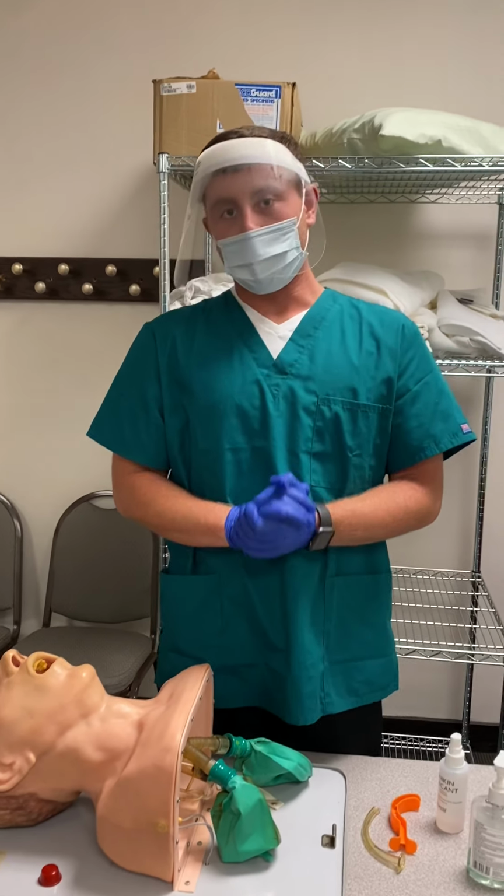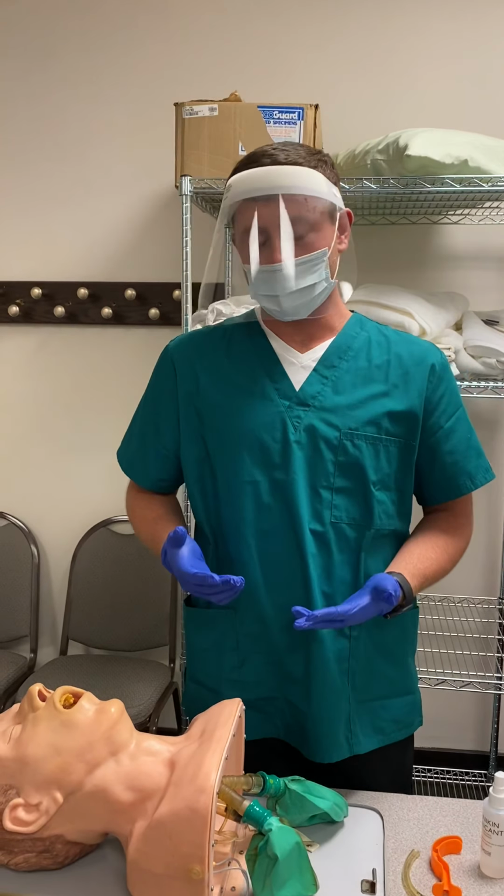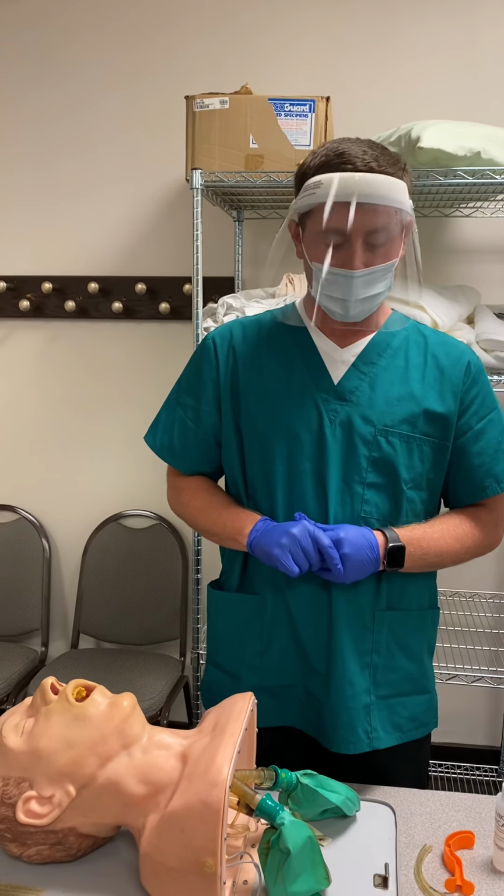Then I will perform vital signs on the patient, most notably the pulse, since they are unconscious, I want to make sure that they don't need CPR.